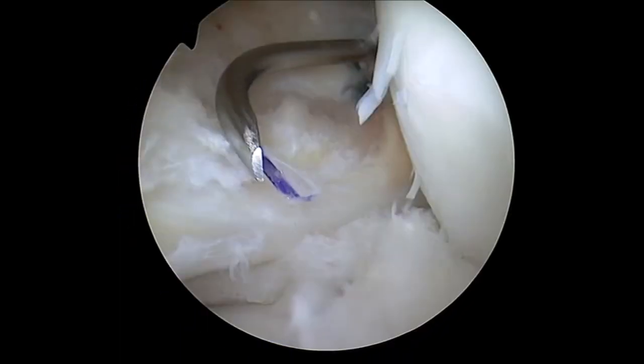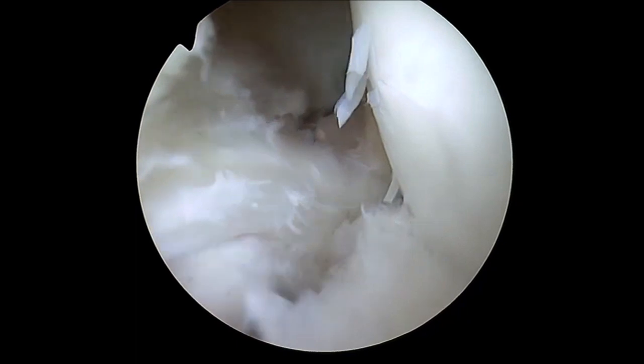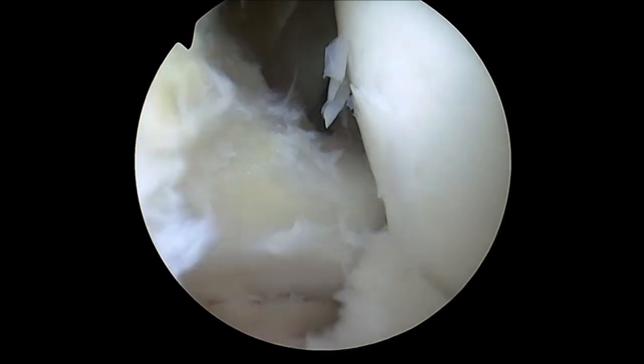Debridement of the lesion is performed using a shaver. Then, a 25-degree suture hook loaded with number 1 PDS is inserted in the posterolateral portal and stitches the outer layer of the lateral meniscus.